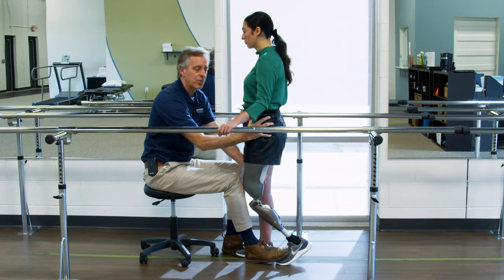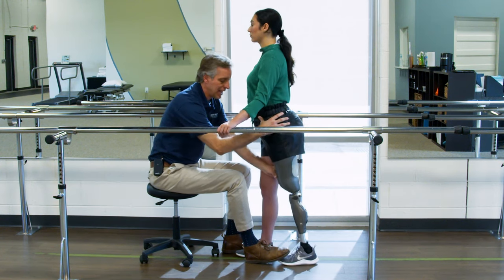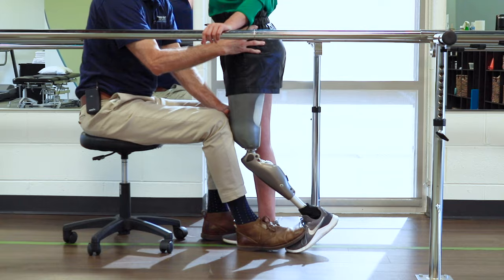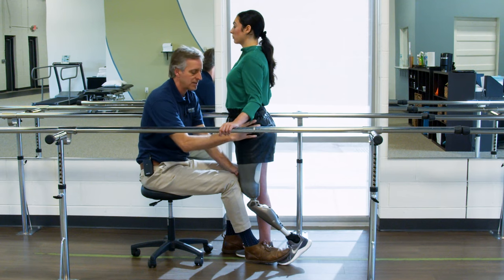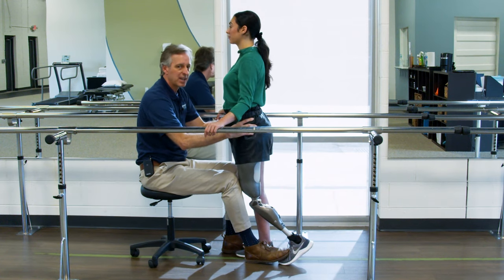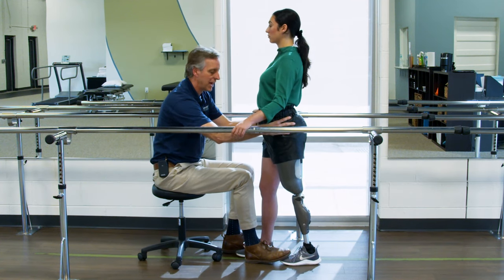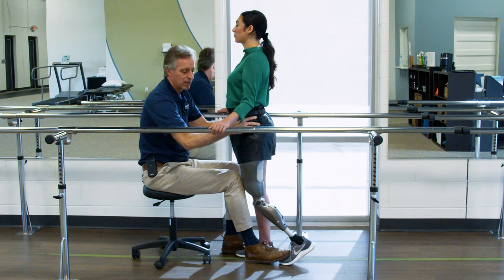What we want to do is keep her in contact with the ground. I'll come to that hip bone in front and say: just bring that hip forward at me — don't pick your leg up. As she does, that knee wants to bend passively. I'm not telling Tracy to bend her knee — that's a mistake. If she tries to bend her knee, her hip will have to go backwards. What we want is: leave that leg behind you, a lot of weight on the toe, and bring your hip at me. As that hip comes forward, the knee bends. If it bends passively, her energy is still moving forward, allowing her to take the step. So Tracy, push into my hand, come right at me — and that knee bends. You don't have to try to make it bend; it bends itself.